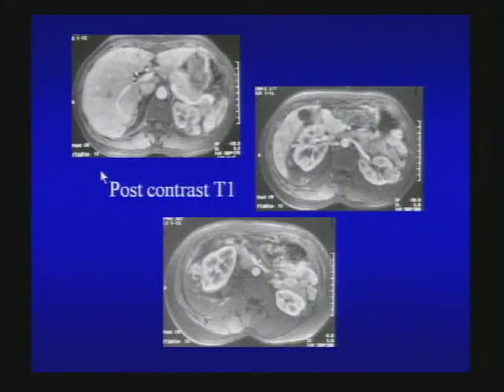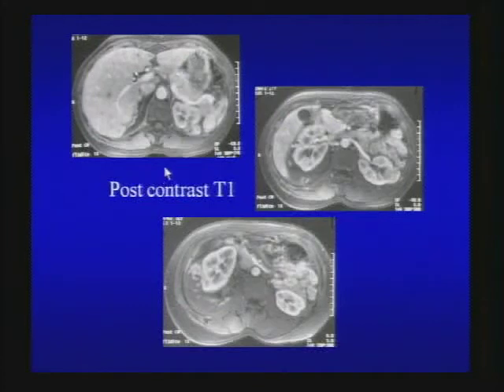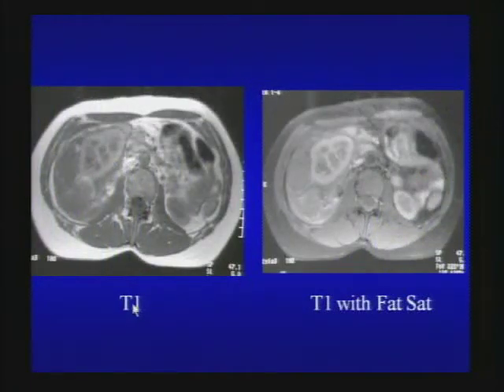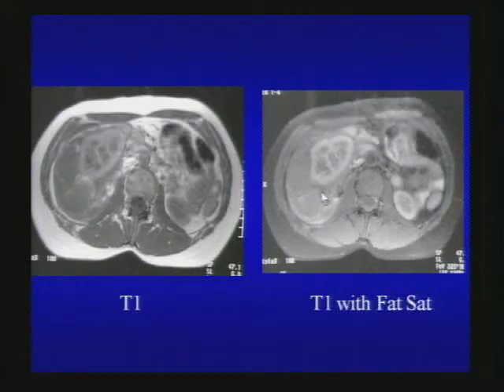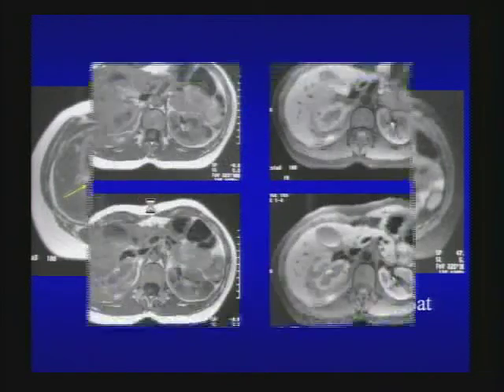Now we have multiple images for this case: bilateral renal masses with hemorrhage. Non-contrast CT shows a right perinephric hematoma and multiple renal masses — on non-contrast you can suggest a fat component. The patient got contrast-enhanced MRI demonstrating solid enhancing bilateral renal masses. Is this RCC with blood or angiomyolipoma with blood? On oral boards, ask for non-fat-sat and fat-sat T1-weighted images. A non-fat-sat T1 image demonstrates T1 hyperintensity in the exophytic right renal mass with signal loss on fat suppression — consistent with macroscopic fat in renal angiomyolipoma causing retroperitoneal hematoma.